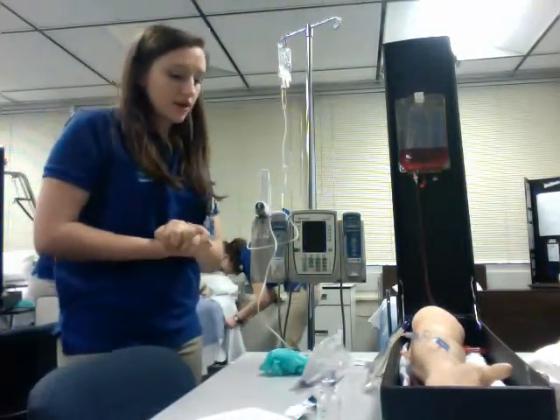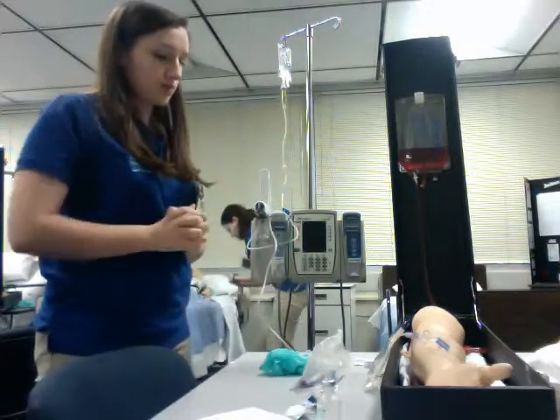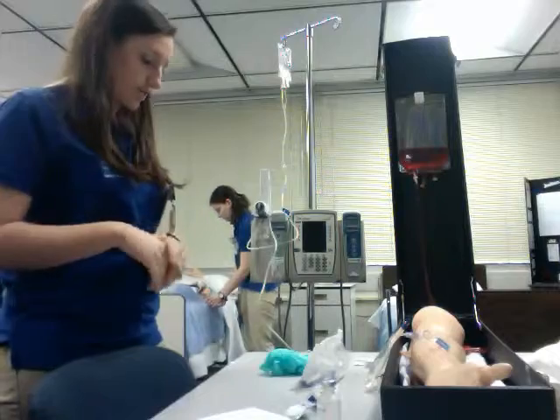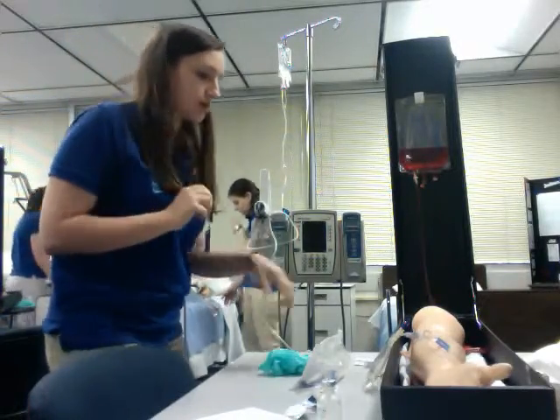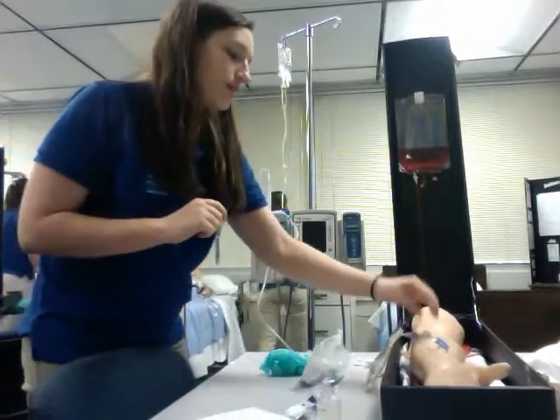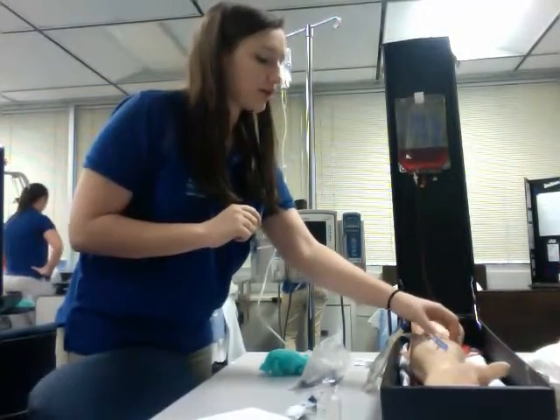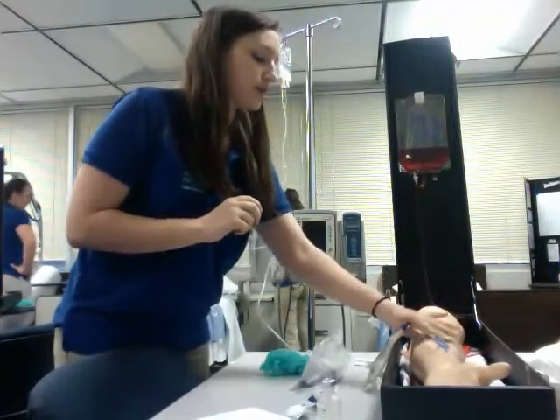Hi, Mr. Smith. I'm Chelsea. I'm going to be your nurse today. Your doctor ordered that we give you some Flagyl to get rid of that urinary tract infection. So I'm going to check the patient's wristband for name and date of birth. And then I'm going to assess the IV site. Again, make sure there's no phlebitis or anything abnormal, and it looks good.